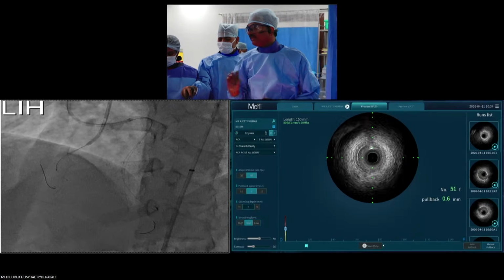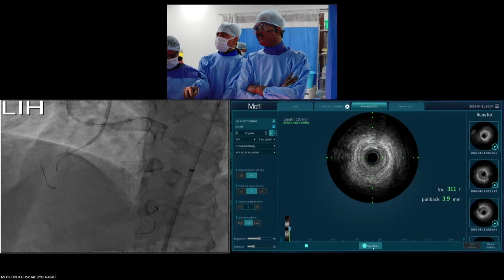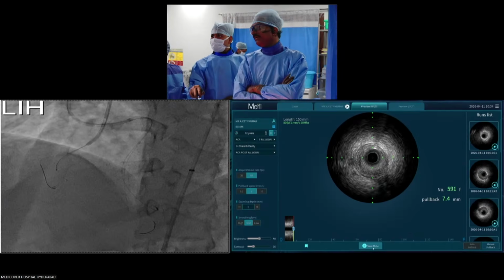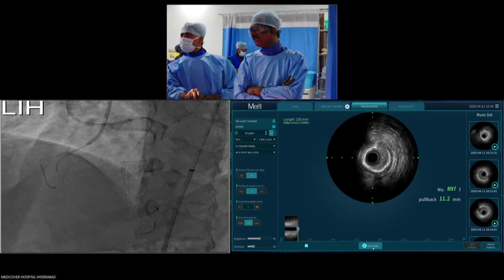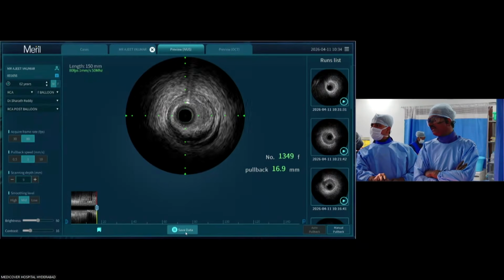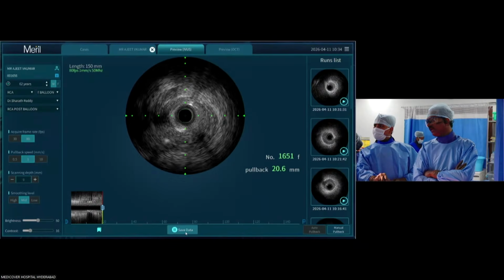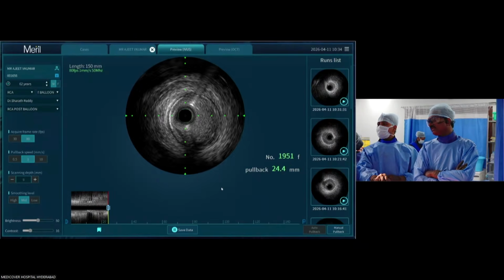Again, I don't see much residual. Probably Dr. Daya will calculate plaque areas, but for me, this is one spot where I'll probably dilate. But if I look at the MLA compared to the distal lumen, MLA is okay for me. Yeah, a flap is also seen, yes.